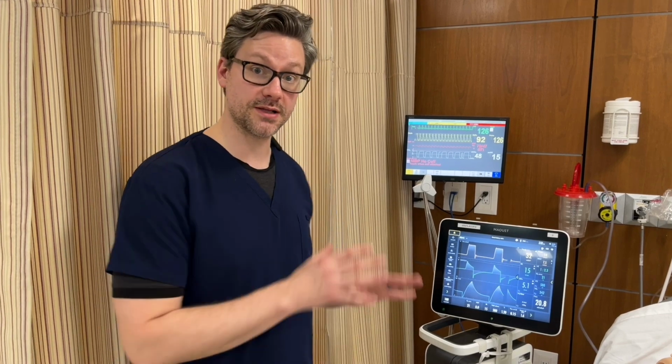After our patient assessment and our assessment of the mechanical ventilator, we want to ensure that we observe and monitor any changes or trends to the mechanical ventilator. After that, we're going to perform an arterial blood gas analysis. If there are any abnormal findings on our blood gas, we can make changes to our mechanical ventilator to optimize ventilation and oxygenation.